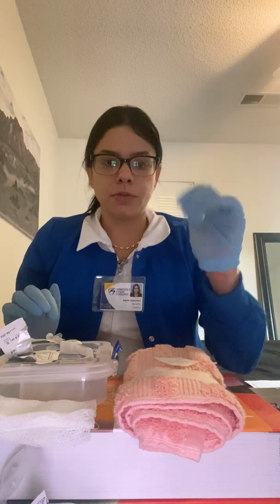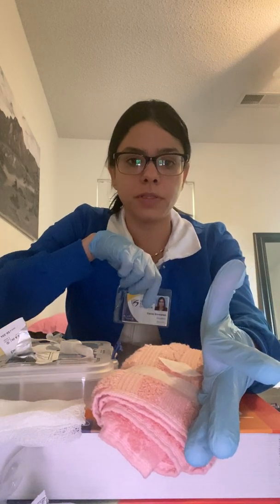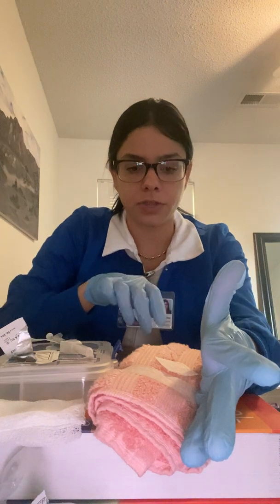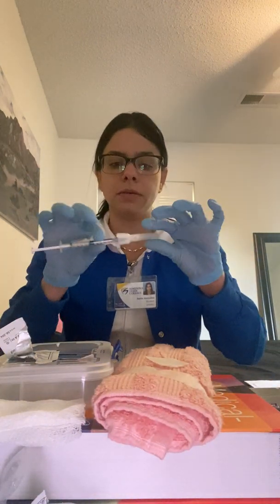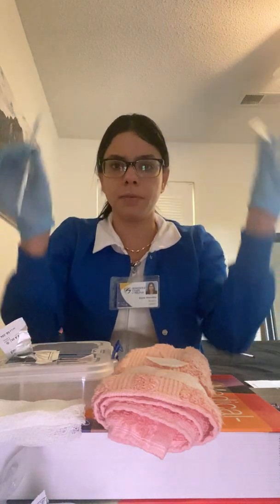Okay, so once it's air dry, I am going to be using the Z-track technique, which is basically I'm going to use my non-dominant hand and do this movement. I'm going to be moving, like rotating, the patient's skin like this. And then right there where I'm pointing with the alcohol pad, that's where I'm going to be injecting. Okay, but before I do that, I need to open my needle doing the rainbow technique.